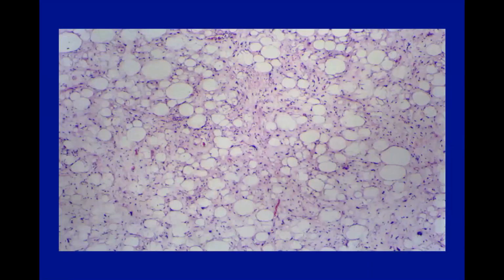That translates to very characteristic features microscopically. If you look at this lesion at low power, the first thing you notice is there is a lot of adipocytes, right? A lot of mature adipocytes. But these adipocytes show a lot of heterogeneity, both in their size and their shape. And that heterogeneity is largely due to the fact that there is an increased amount of non-fatty tissue in the background. And when I see this on gross, as I showed you earlier, or I see this on microscopic, as you see now, I get worried that this is something more than an ordinary lipoma.